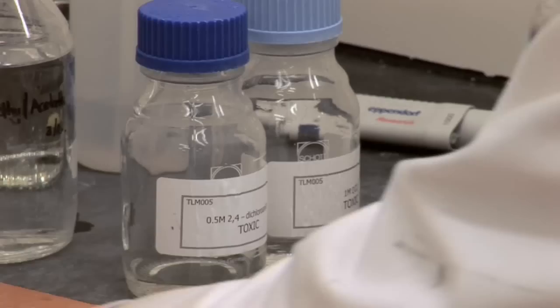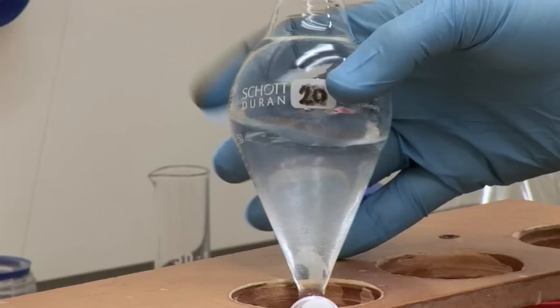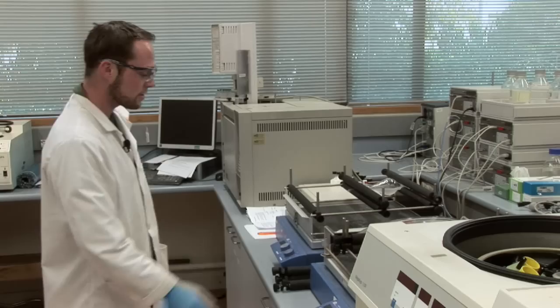reaction. So it's called DCC, dicyclohexylcarbodiimide. 2 mils of dichloroaniline. Essentially they'll react with and wrap the 1080 to form like a volatile compound. So now it goes onto the shaker for 1 hour.